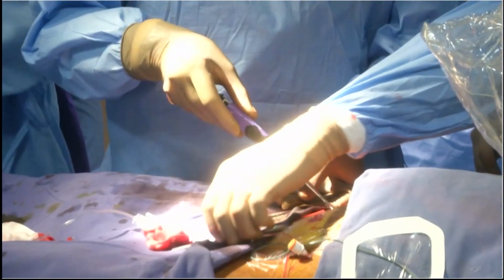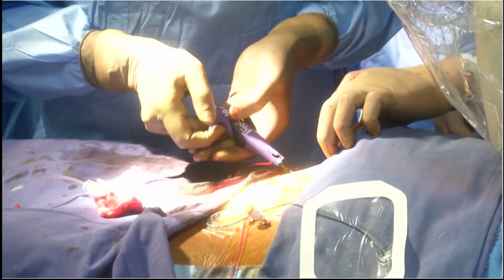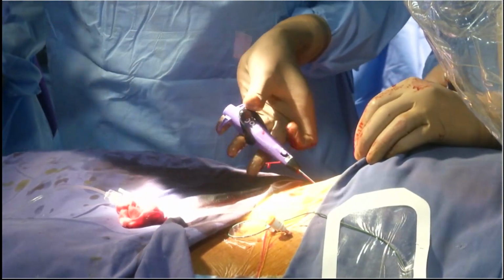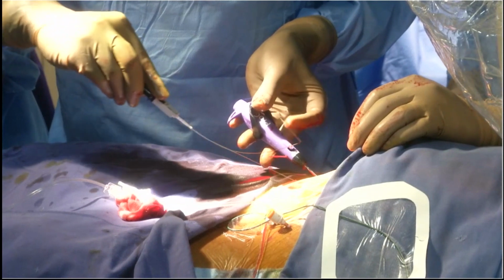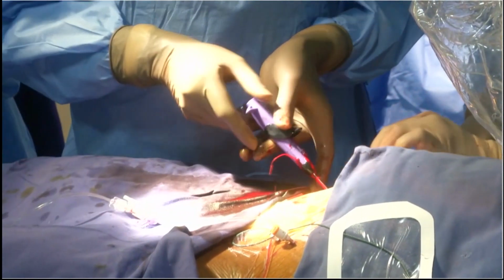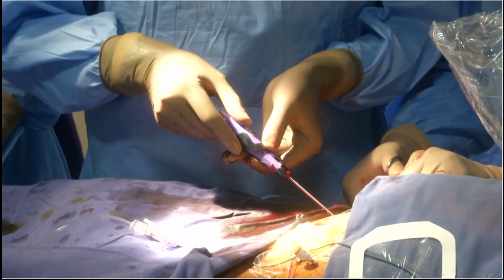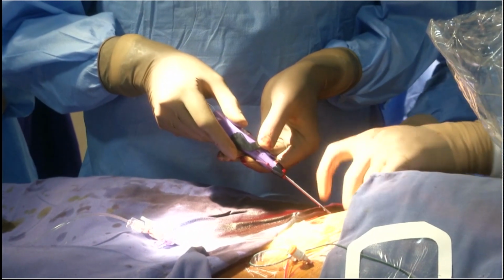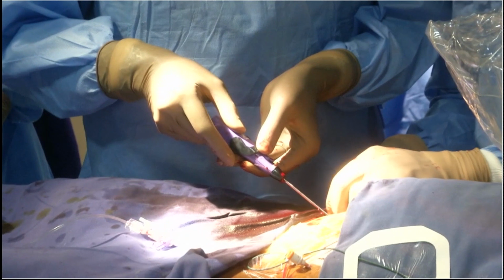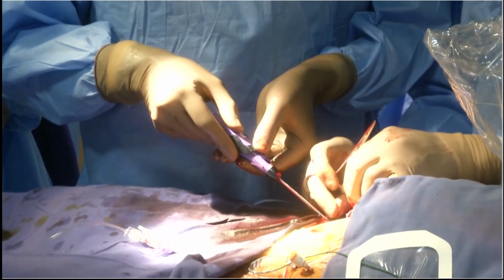Actually, we started our experience with 2 ProGlides, but we only tightened 1 because Japanese patients have very small access vessels. Nowadays, we only deploy 1 ProGlide, also for financial reasons. Usually 1 ProGlide is sufficient for hemostasis for 14 French sheaths, and in case that doesn't work, we may add 1 Angio-Seal 8 French. That is our current practice.